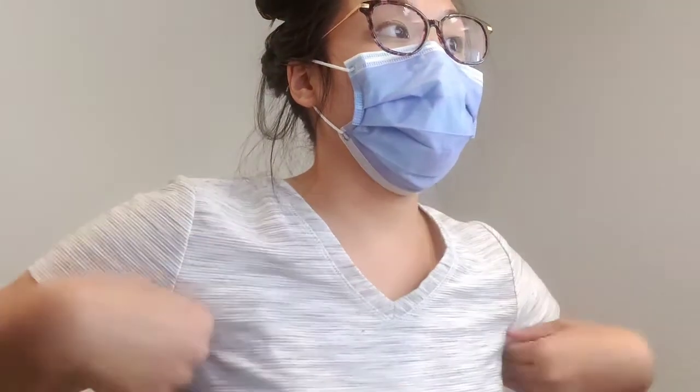Next question, the topogram image for routine abdomen should include your axilla. So when you start, you zero it out. You call it the nipple line, or you can also reference your axilla, so your armpits or your nipple line. So start there and you end at the iliac crest, the bottom of the pelvis. That should include your abdomen, because you want where your diaphragms are, and that's about your axilla area. Axilla, nipple line, whatever.